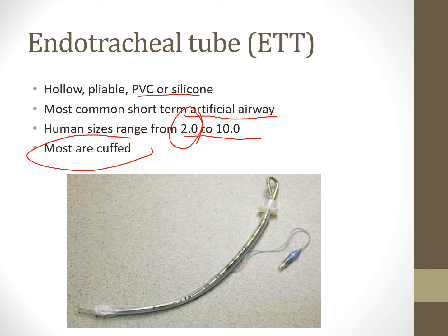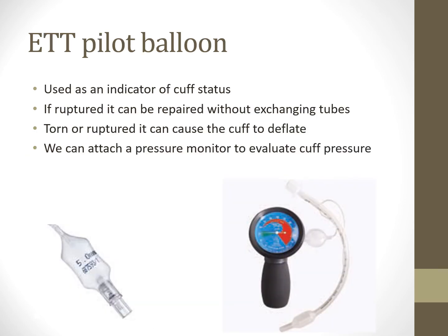And this is what you're looking at. This one has that stylet in place. That stylet is that metal tube that's inserted here, and it gives it that rigidity, that structure. So when we go to intubate, we can still go anterior, we can still make sure we have all the structures available. The pilot balloon, this is a little thing on the edge of it, and hopefully you guys talked about this already a little bit in therapeutics.